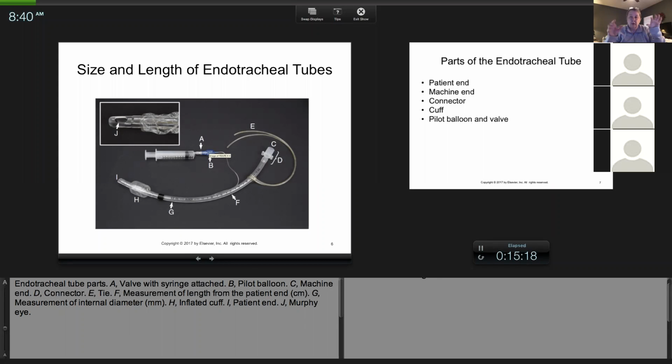We had roll gauze, which was thin gauze, and that's usually what I used. When I put my tube in, I would tie it around the tube, and then tie it to the top jaw. On cats, I usually tie it behind their ears, but on dogs, as long as they had a decent snout, I'd tie it to the jaw. If it was a Frenchie or a Boston, I would tie behind the ears.